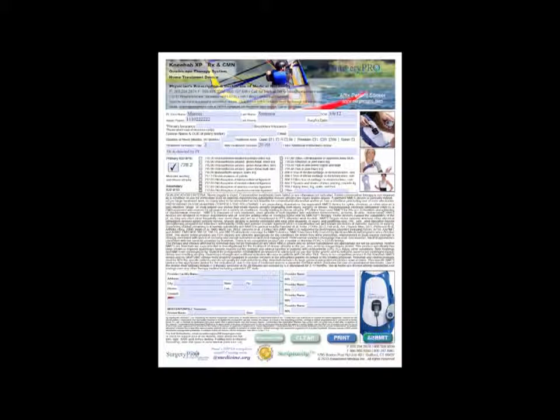Now, we've just gone over print. Just before I go on to the submit button, perhaps I have taken this form from its original state, and I want to have my doctors pre-completed here. I'll enter my doctor information. Maybe I have 4 doctors that might prescribe this device. I enter my facility information, and then I save that file as my master template.